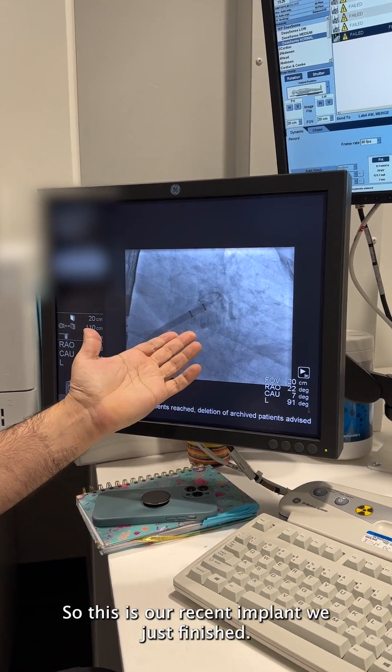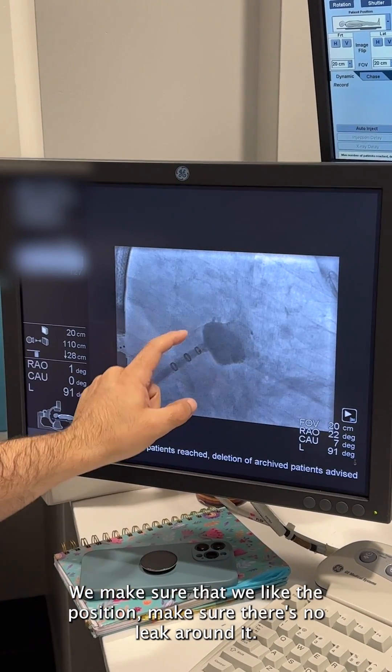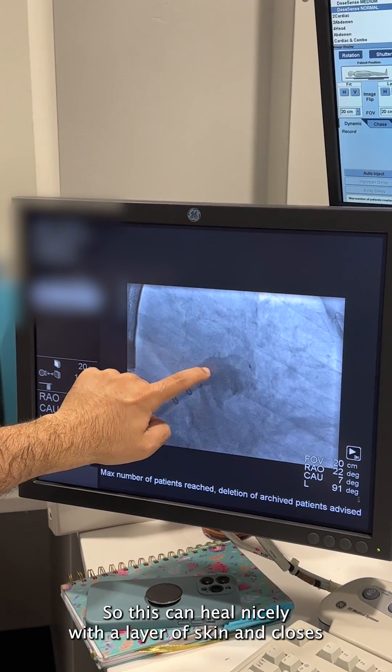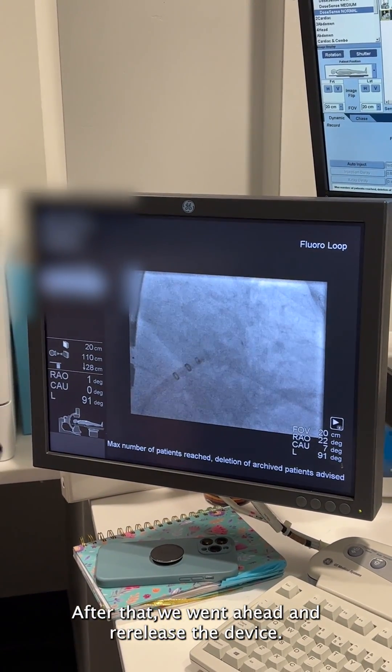This is our recent implant we just finished. This is an x-ray picture of the heart — this is how our device looks. We make sure that we like the position, make sure there's no leak around it, so this can heal nicely with a layer of skin and closes and shuts off the entire appendage. After that we went ahead and released the device.